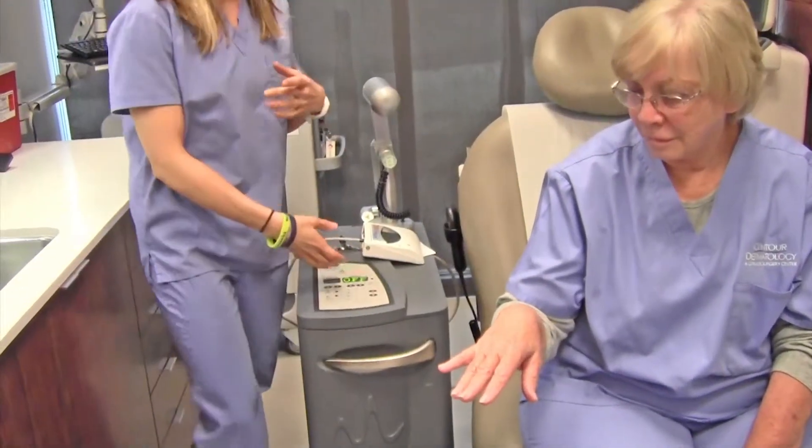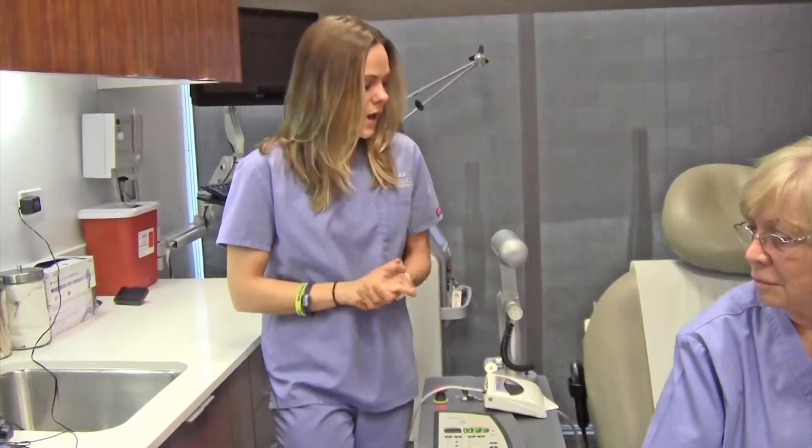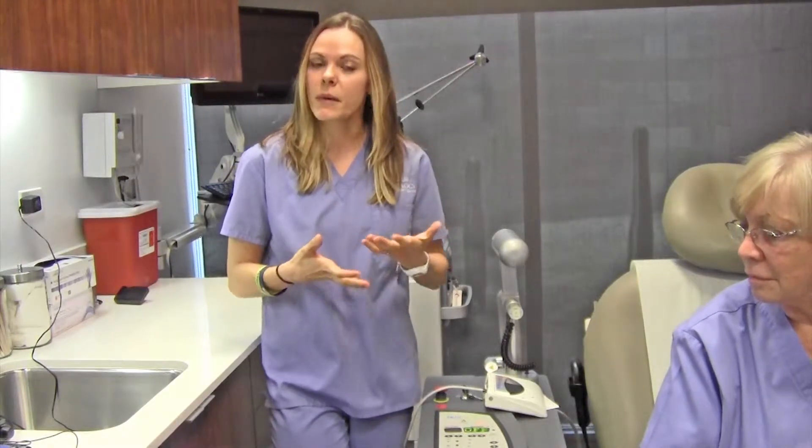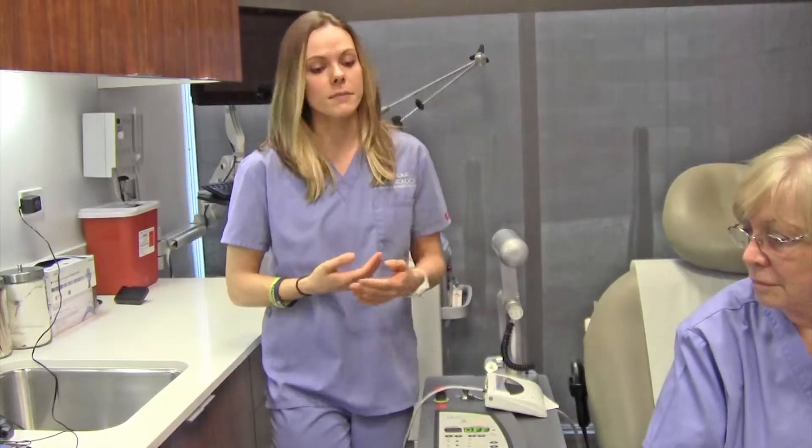What this laser does is it uses a special light, and the light is absorbed by the melanin, which is then broken down, and the pigmented lesion is lightened. Typically, you need about one to five treatments, depending on the lesion color. If it's darker, you may need more than that, so it just varies based on the person.